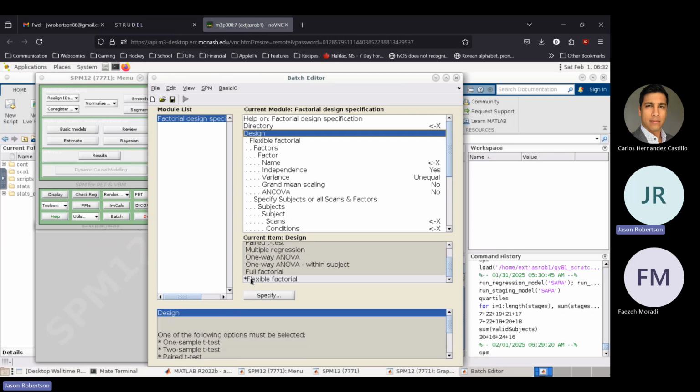So he wants to create a model in which he can actually control for age and control for ICV, but also have a predictor for each site. And a predictor means that you will model the data differently for each site, so you can also control for differences that happen due to the scanner, right? Because the scanner is taking different images, and each scanner might give you different quality or different distortions, right? So you want to control for that.